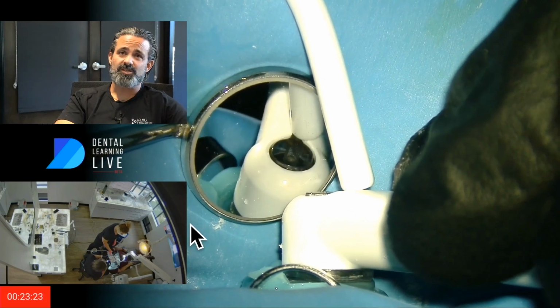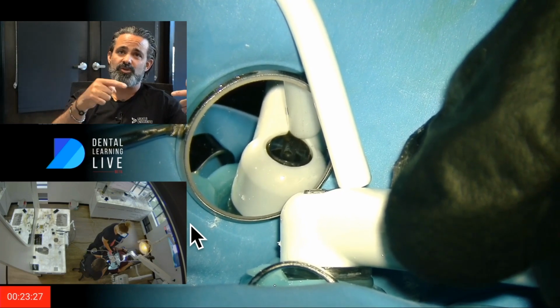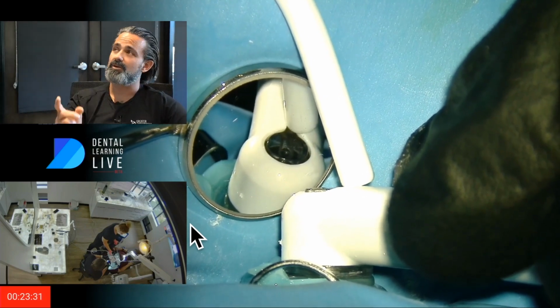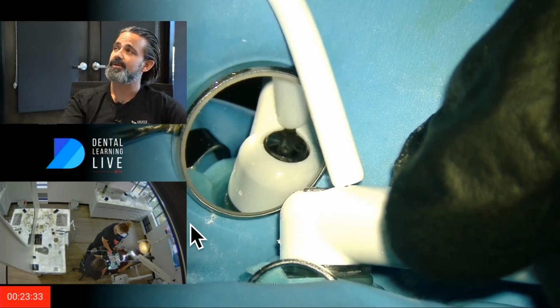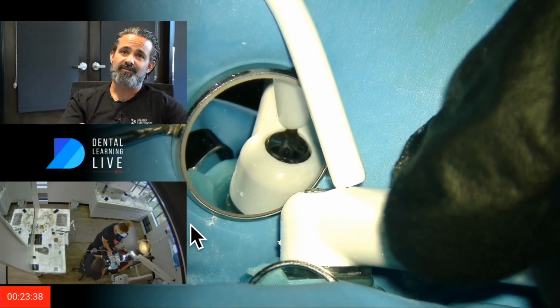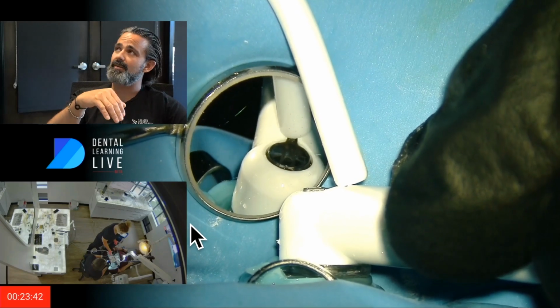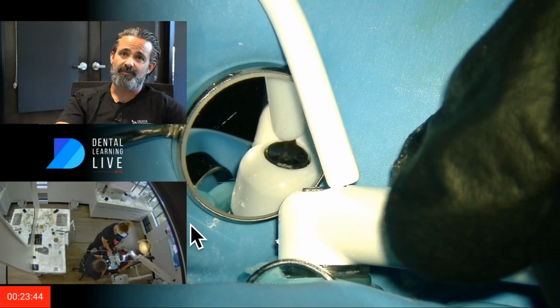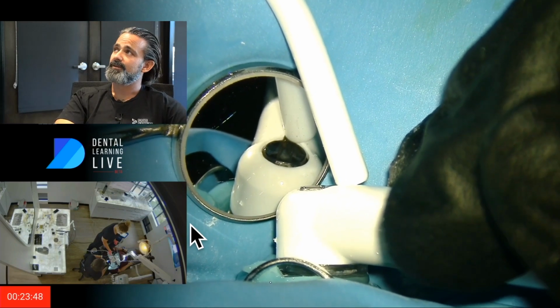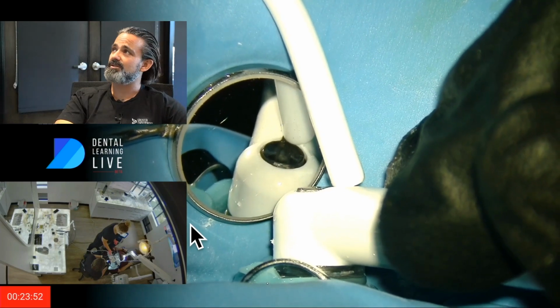But the question is, we had that little apical block, which I call the delta. Likely it was where the 2-to-1 was coming in, and you saw me pick around that with the apex locator and hook something out as it kind of bent the tip of that 10 file. It'll be interesting to see what the GentleWave does in that anatomy, as well as in the coronal anatomy right there at the floor, where we saw that isthmus connection between the buccal and the palatal canal. But you know, things are stable.